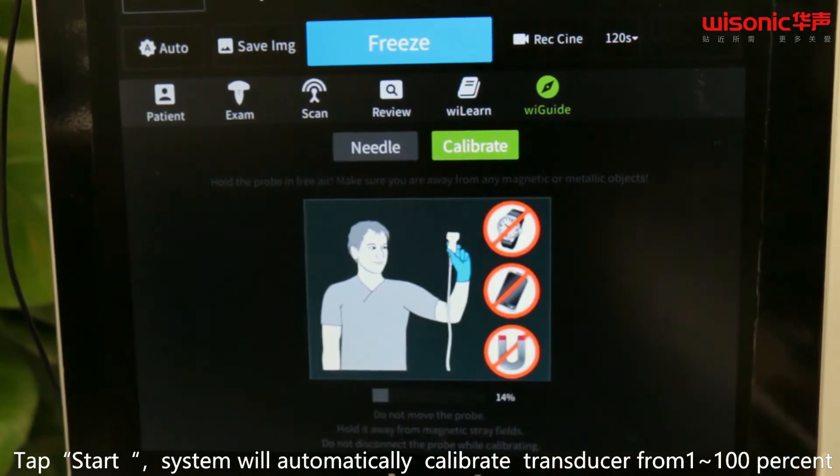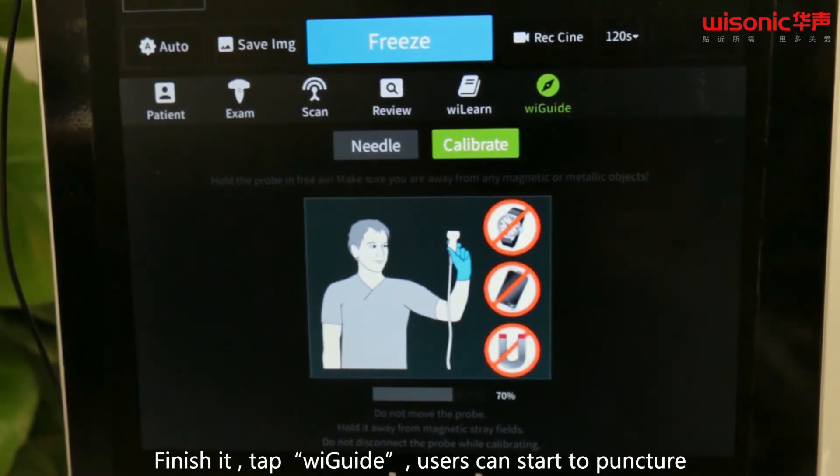Don't disconnect the probe while calibrating. Tap Start. The system will automatically calibrate the transducer from 1 to 100%. Once finished, tap wiGuide.